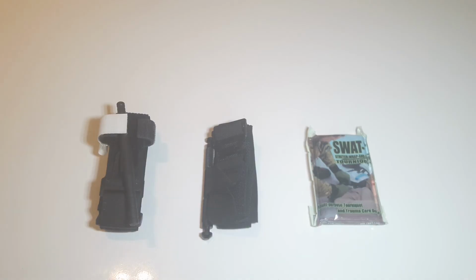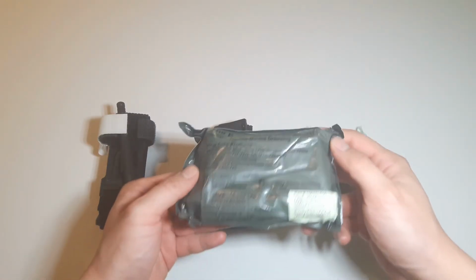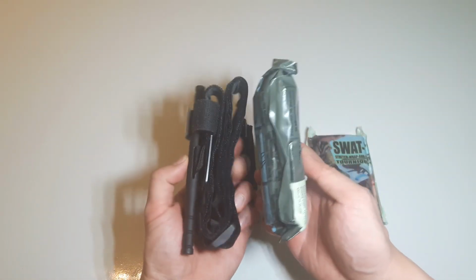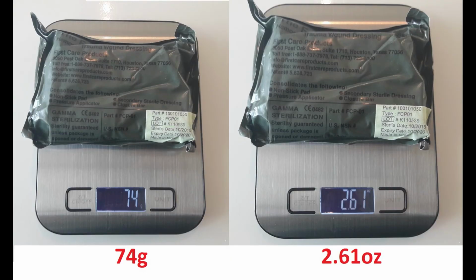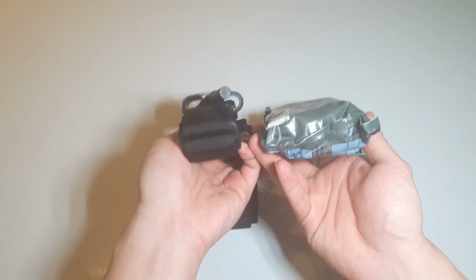There is another cheaper option, and that is the Israeli bandage, which goes for about $8 to $9 depending on if you go with the 4-inch or 6-inch version. This is the 4-inch version, by the way, and while it wasn't designed to be a dedicated tourniquet, it can function as one. It's almost as light as the CAT tourniquet, but it's larger in size. It's not as easy to apply with one hand, but again, it's doable.